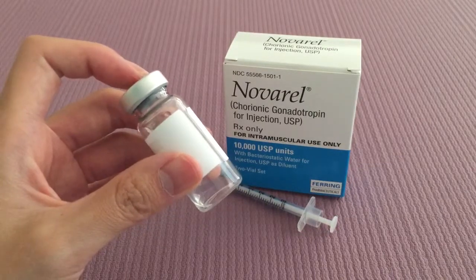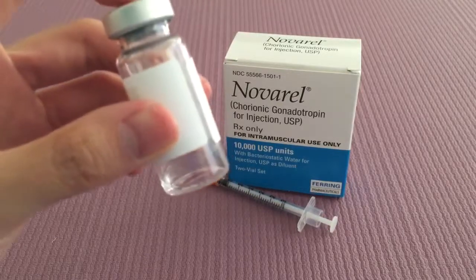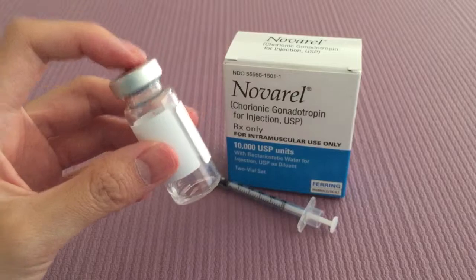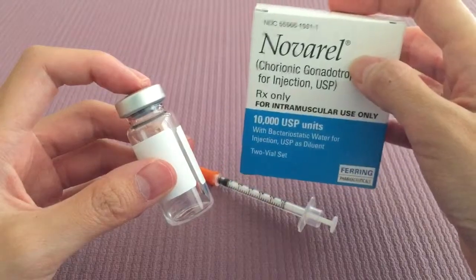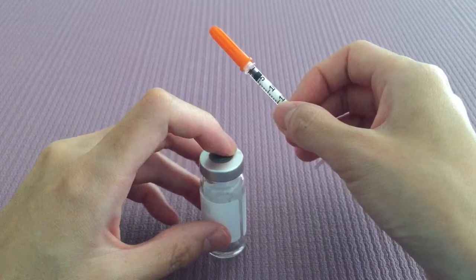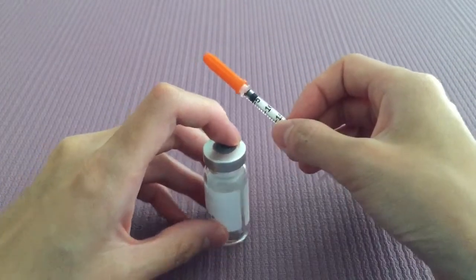Hi everyone, this is Micro HCG. You can see that it's a very clear and watery liquid. You can get your pharmacy to mix this for you. It's actually just diluted Novrel. Novrel is the trigger shot you use to mature your eggs. So let's put that aside. And in front of me I have my 29 gauge half inch needle that I will be using for my subcutaneous injection.